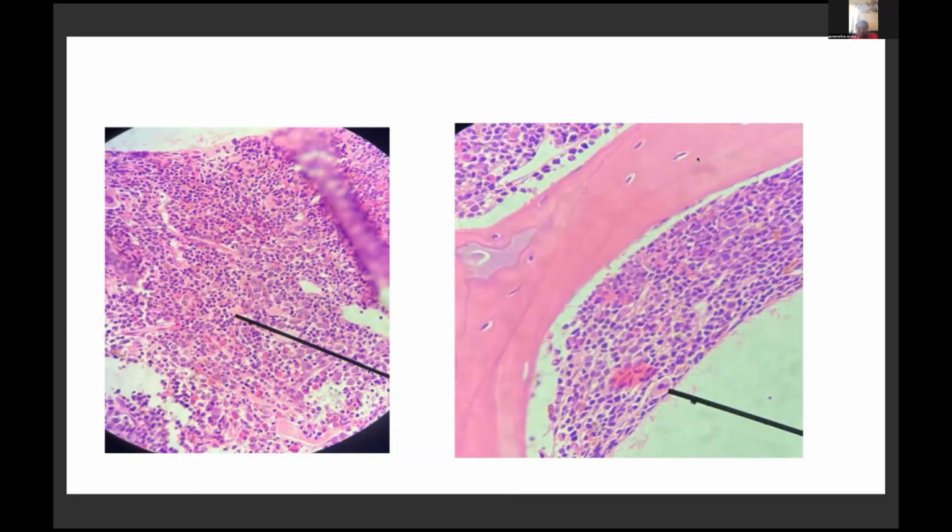This is a biopsy image, and when we are evaluating the biopsy of a post chemotherapy marrow, we also need to keep in mind whether there is some abnormal localization of the normal hematopoietic elements present or not. Because post chemotherapy also in leukemias, you might get some changes which mimic MDS. So we have to be very, very careful in diagnosing a marrow which has come to us after a chemotherapy session. Next slide.